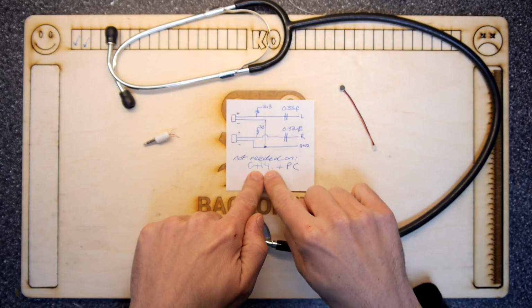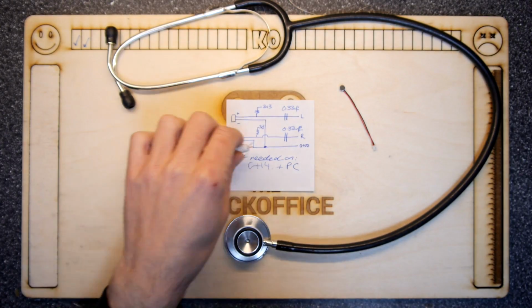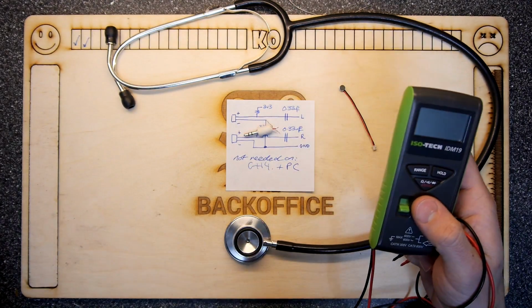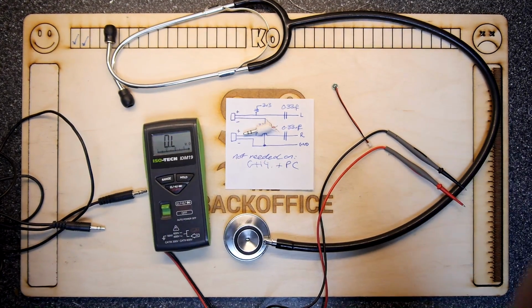However, I've noticed on my camera, which is a GH4 and a GH3, and my PC, I don't need to do this because there is phantom power on the actual computer. And I'll show you how to do this. So you've got two ways. First way is if you've got a cut down jack like that, and I'll zoom in for you, you can have a bit of a closer look.